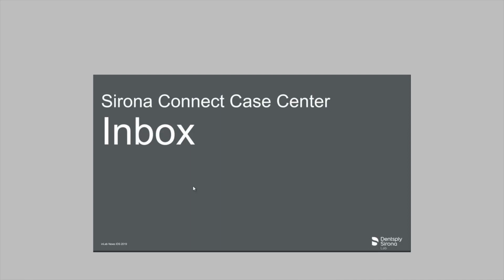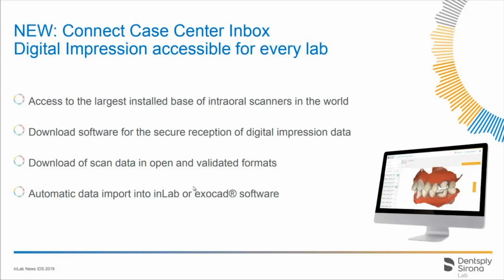We have something new called the Sirona Connect Case Center Inbox. It makes digital impressioning accessible for every lab. You have access to the largest installed base of intraoral scanners in the world. You download the software for the secure reception of digital impression data. Download of scan data is in open and validated formats, with automatic data import into inLab or exocad software.